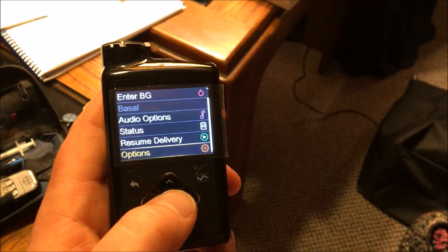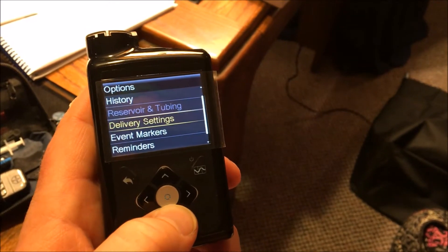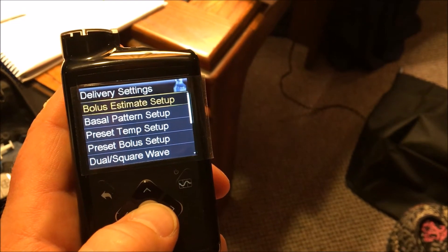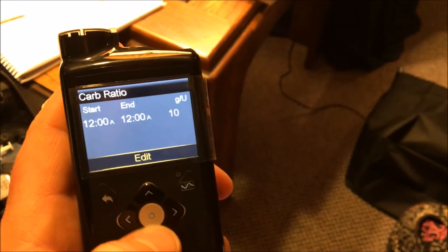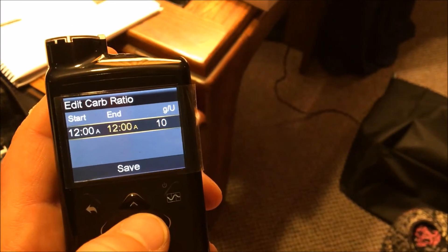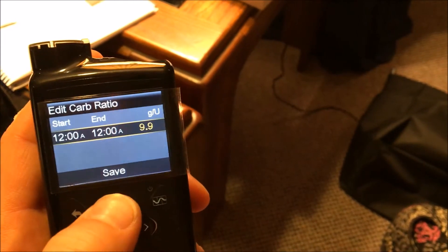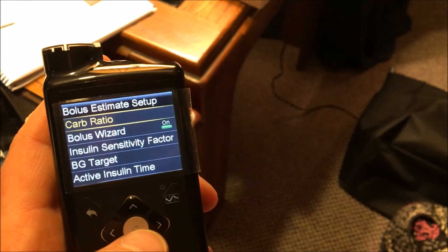It's time to set up our bolus options. We're going to go to Options, then Delivery Settings, and then Bolus Estimates Setup. From there you can program your carb ratio. The time is okay, and it's set to 10 — that's actually correct for me — so I'm going to keep that and save it. Change is saved. My carb ratio of 10 is saved.